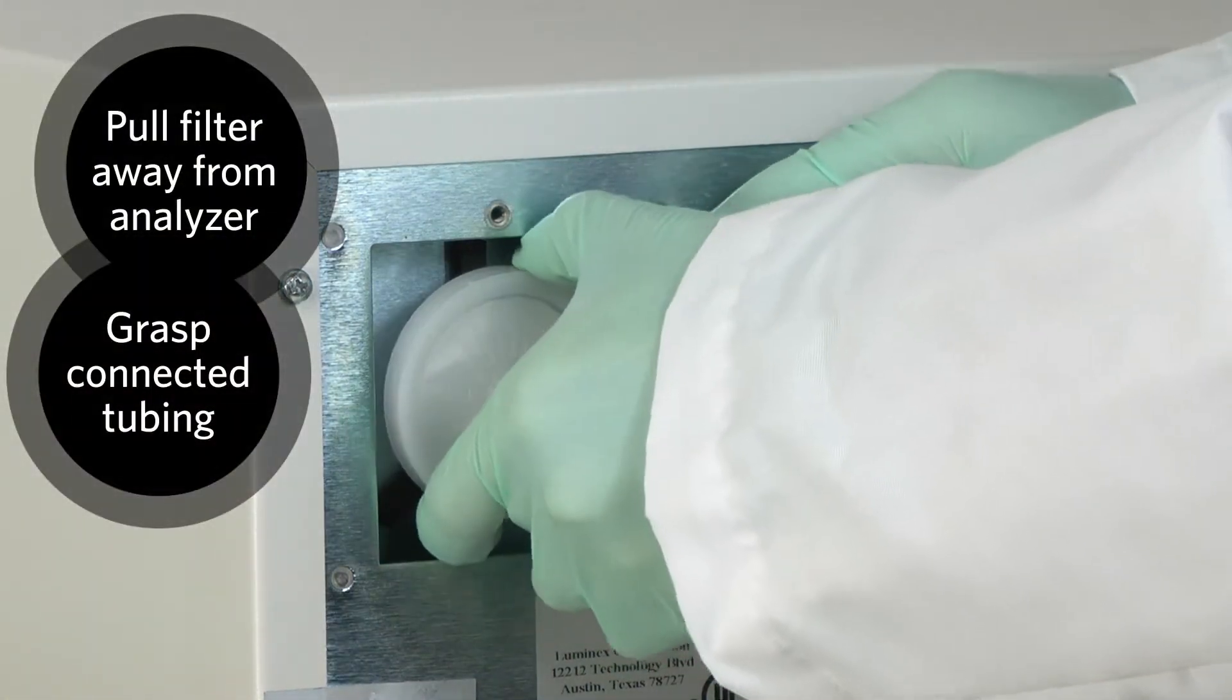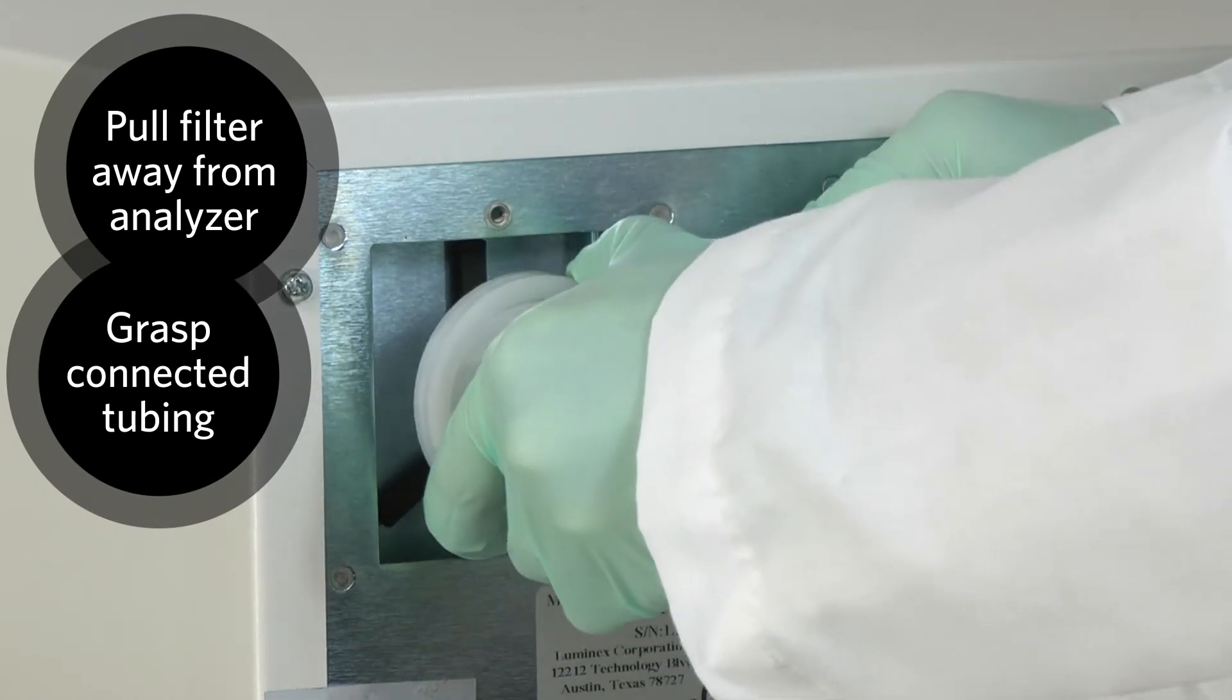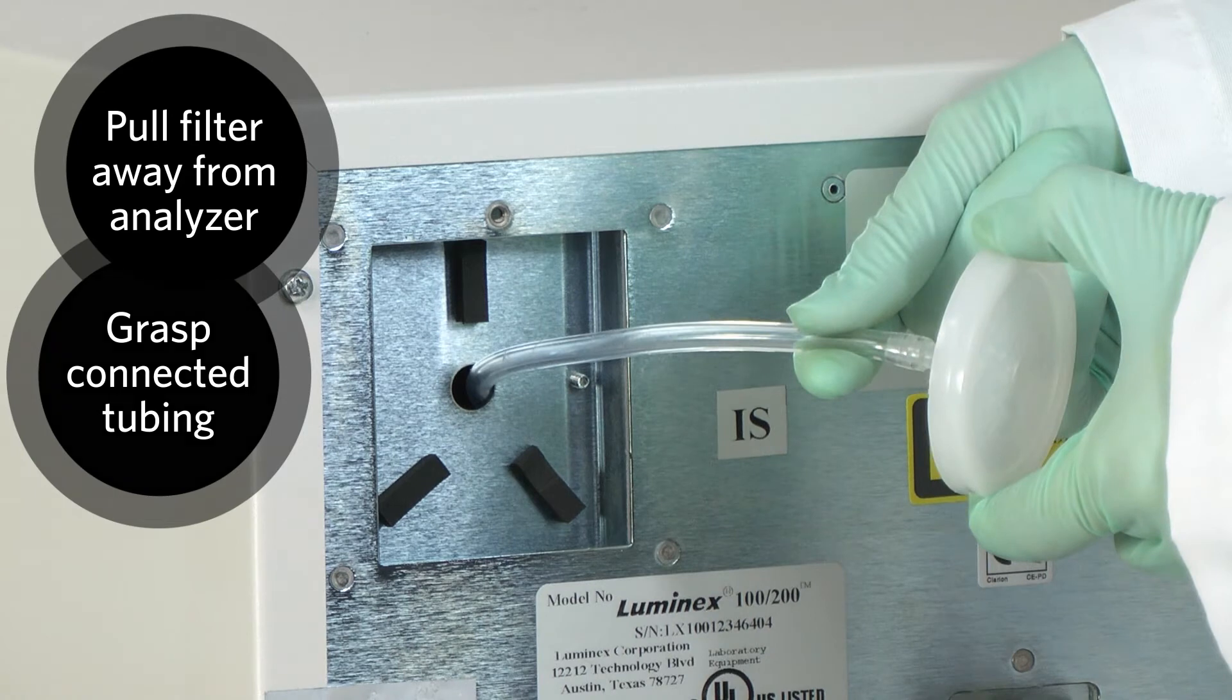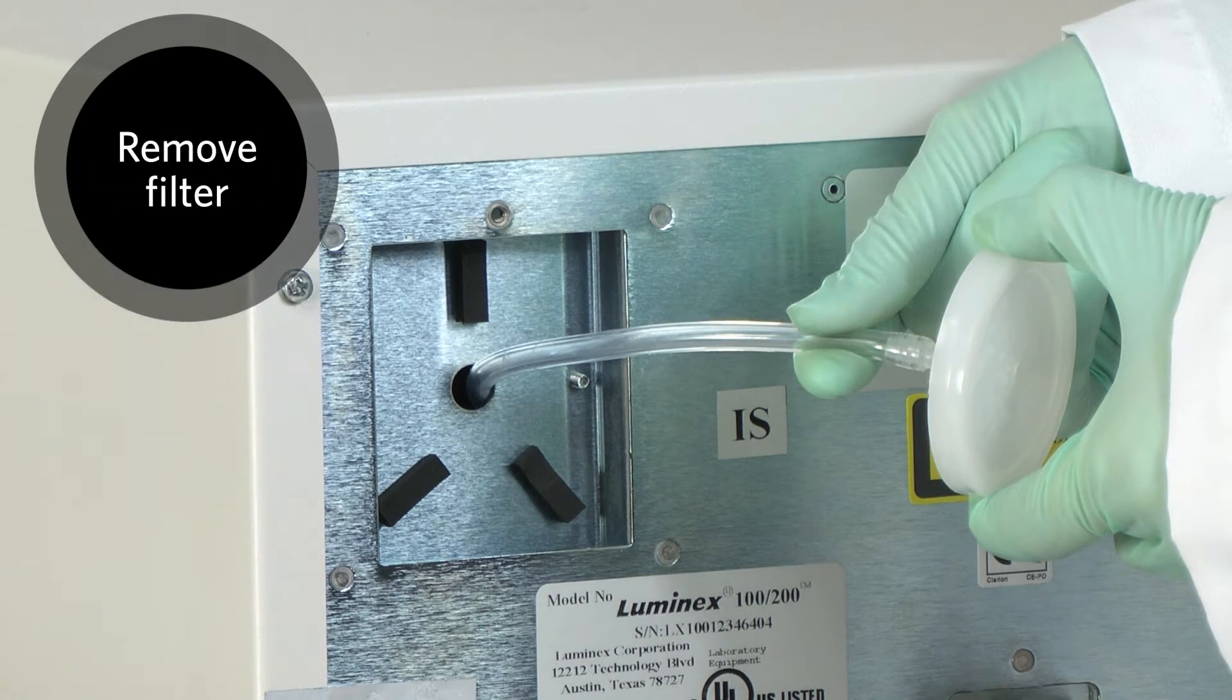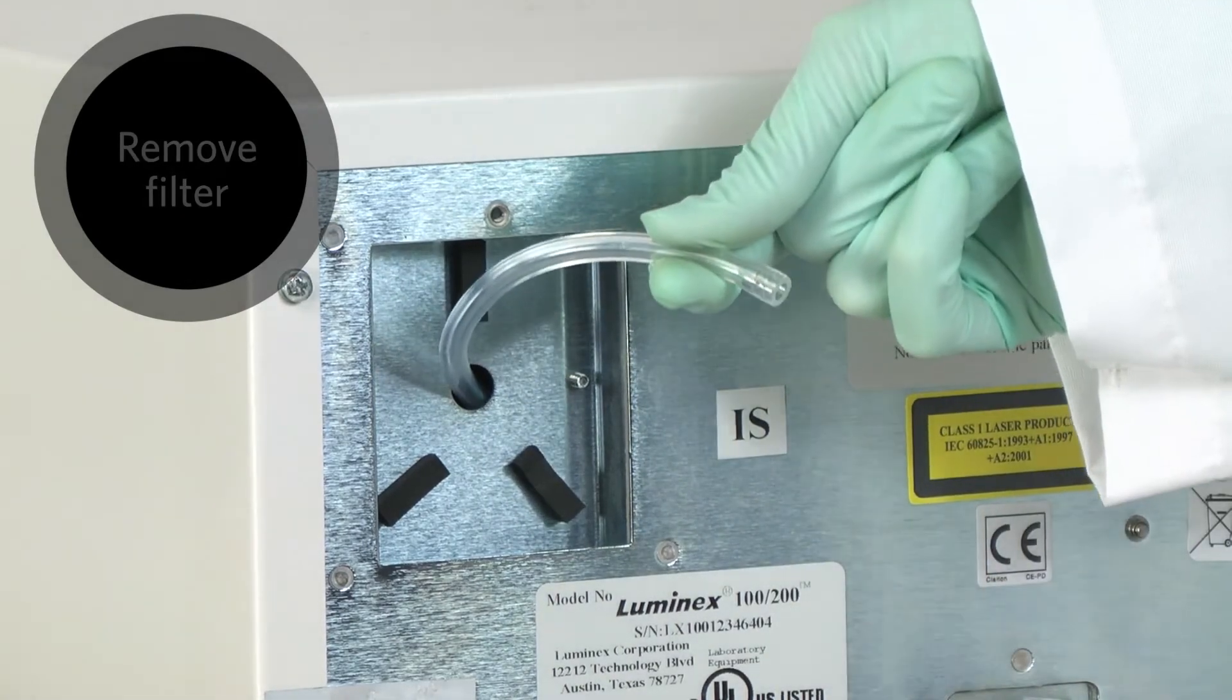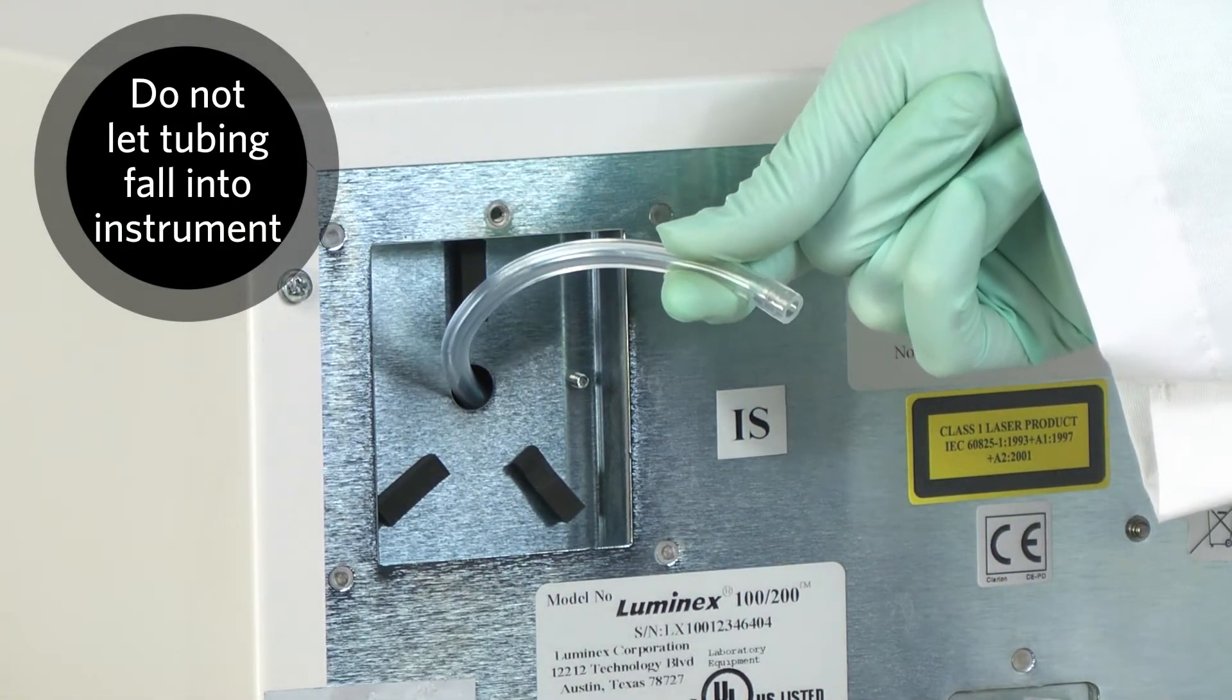Pull the filter away from the analyzer and grasp the connected tubing. Pull the filter 3 to 4 inches from the unit. Remove the filter with one hand and hold the tubing with the other hand. Be careful not to let the tubing fall into the instrument.